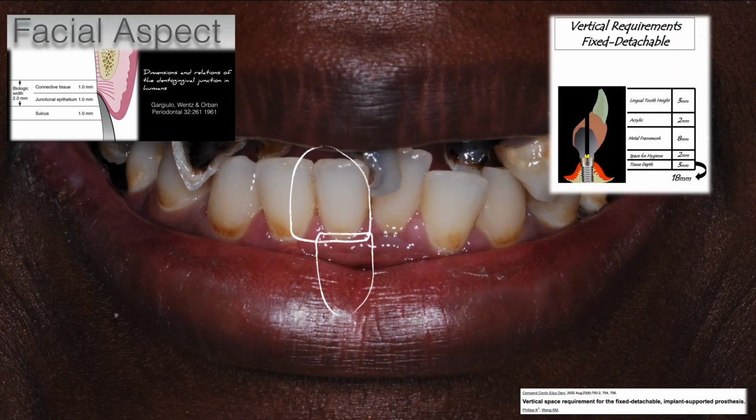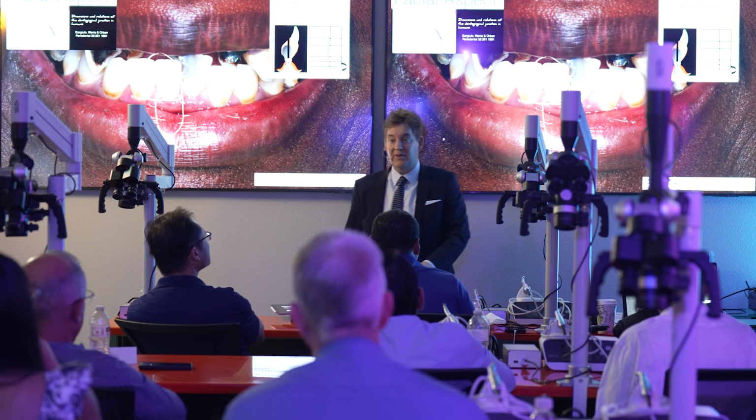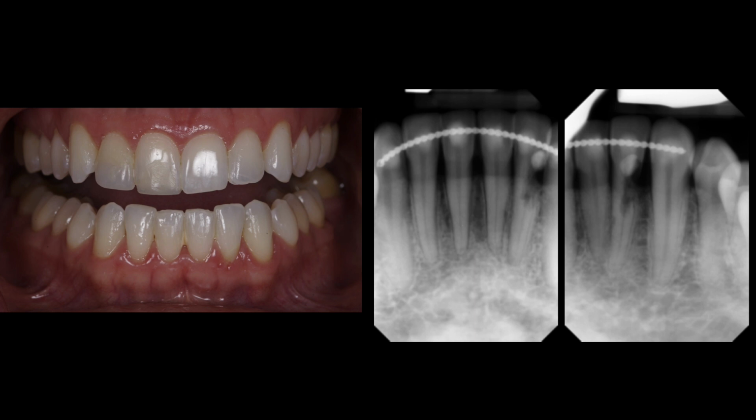So that would mean her bone is right there. Her bone currently is right here. It would ideally be right here, but you and I, my friends, need 18 millimeters from here to the platform of our implant. Now, to the contrary, if we were treating just that single central, look at this patient.